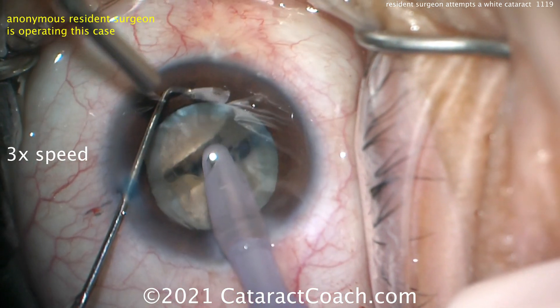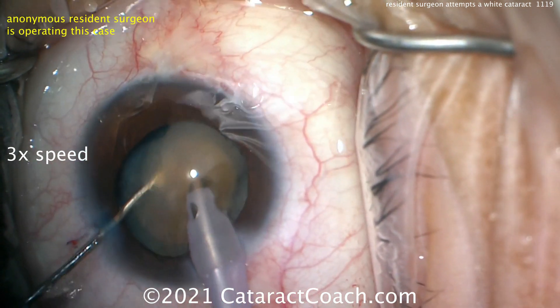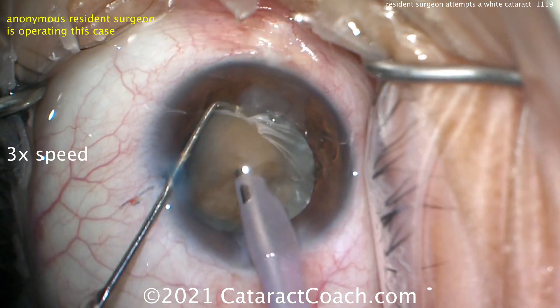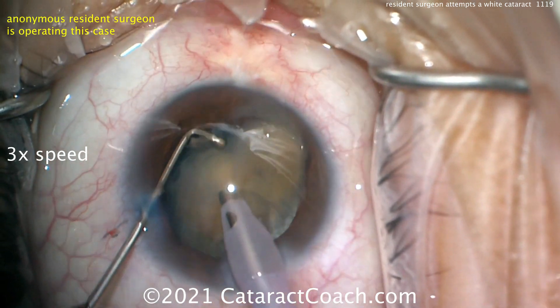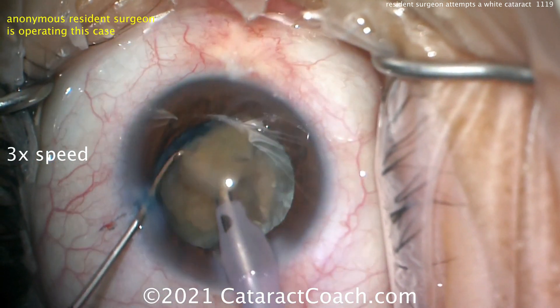That's fully separated now. Going to chop mode — looks like a stop-and-chop technique. Bringing that nucleus up — beautiful technique. I like how the right hand with the phaco probe retracted and pulled the nucleus up out of the capsular bag, which makes it a lot easier.